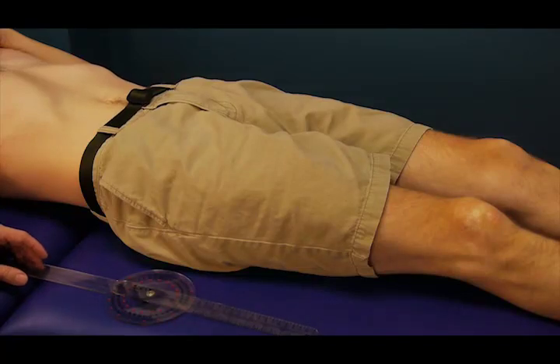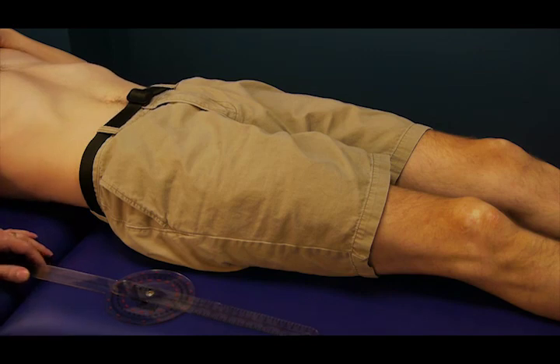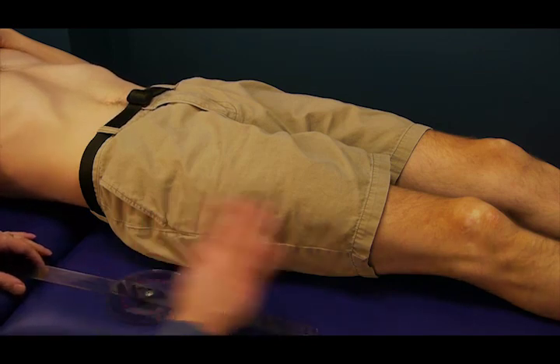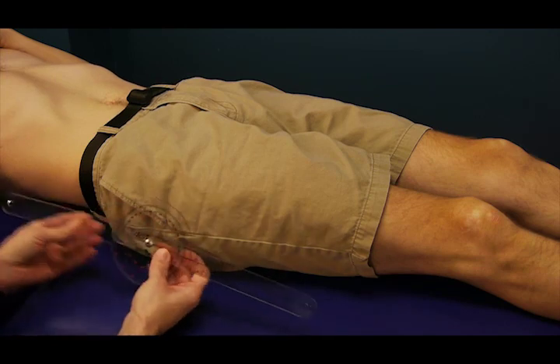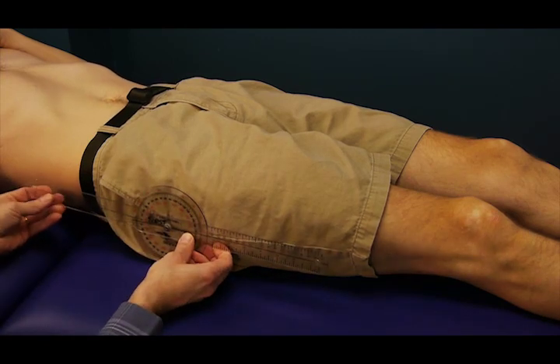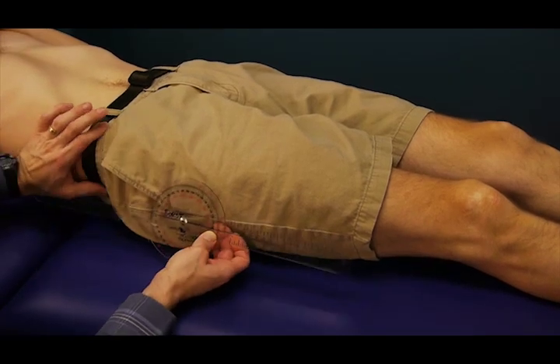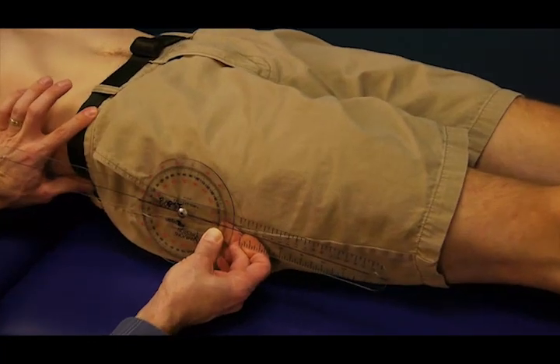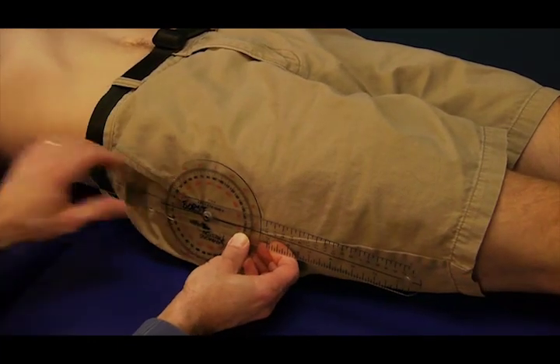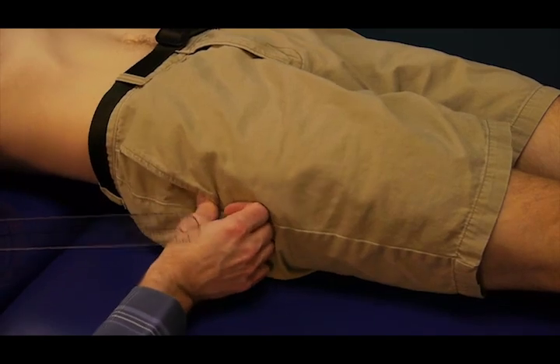To measure hip flexion active range of motion, the patient is positioned supine on a mat table and the leg is extended to begin with. The goniometer is placed on the lateral aspect of the hip. The stationary arm is lined up with the middle aspect of the side of the pelvis. The axis is lined up with the greater trochanter, right there.